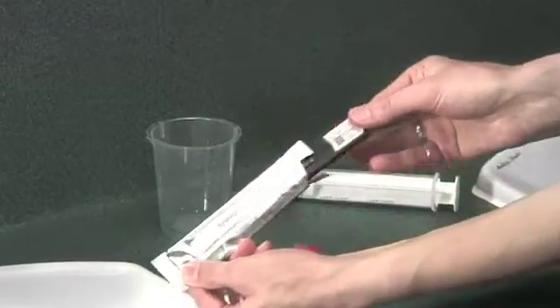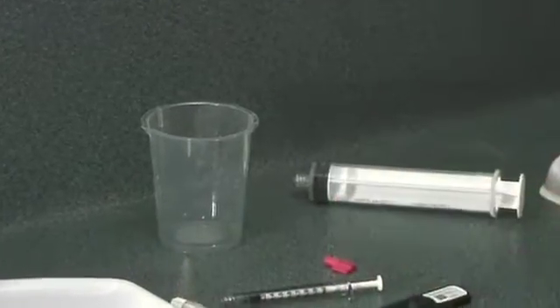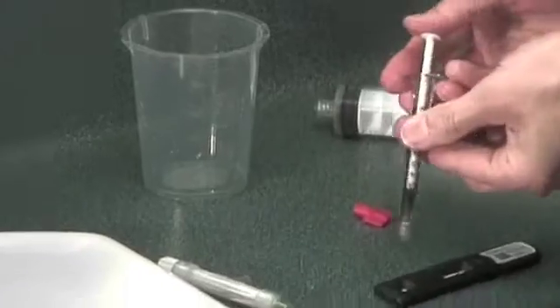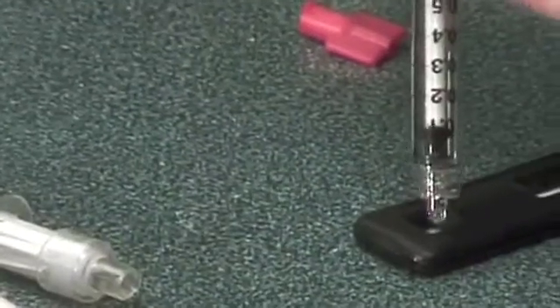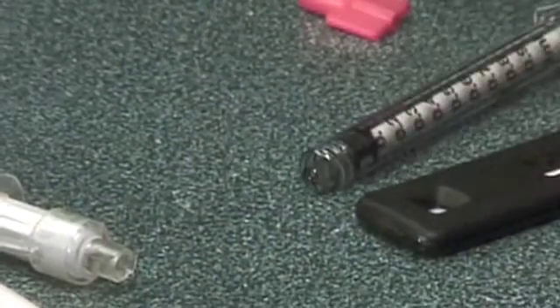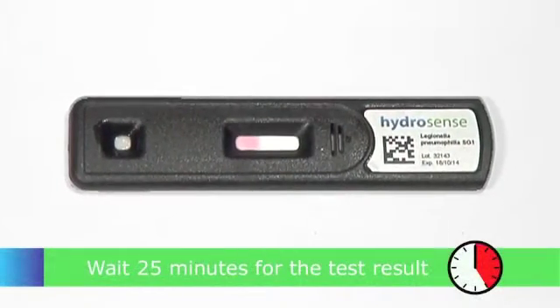Remove the HydroSense test strip from the pack. Drop the contents of the small syringe onto the sample point on the HydroSense strip. Leave the strip for 25 minutes on a flat surface.